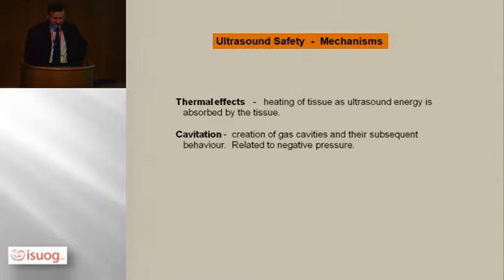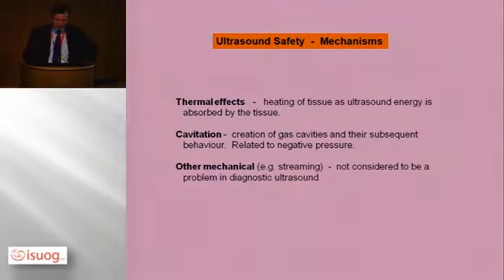Right, we're coming to the end, and I just want to talk for the last 2 minutes on safety.